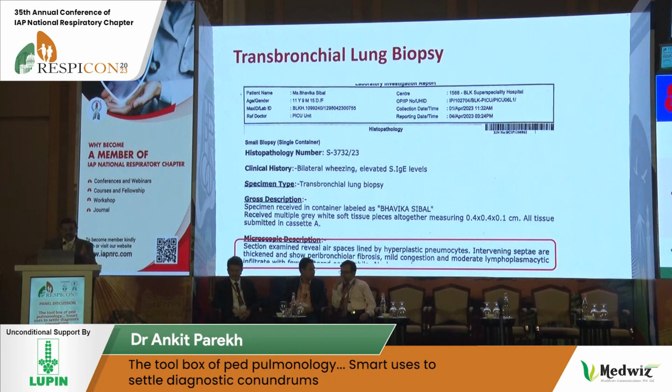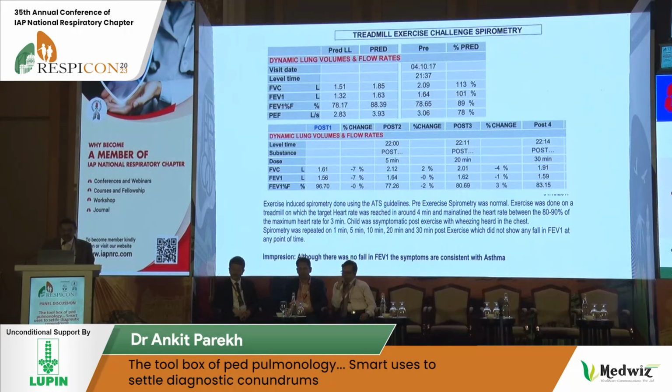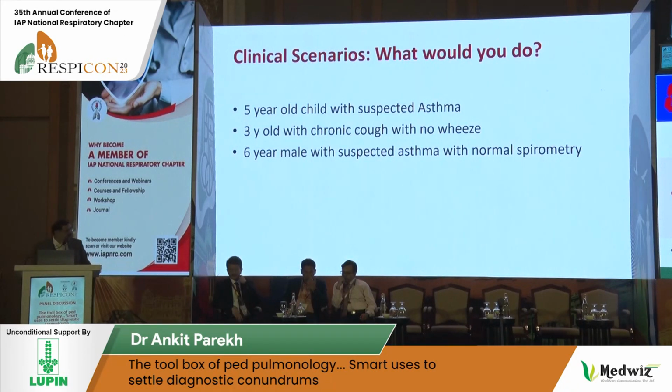So again, a child presenting with cough, a child presenting with wheeze and breathlessness, clinically being managed as asthma for the past 1 year or so. A lung function which helps you to understand, well, you're not dealing with asthma, you're dealing with an asthma mimic. Right, so I think I'll just skip this case on exercise-induced breathlessness and go on to, because I have 7 minutes left.